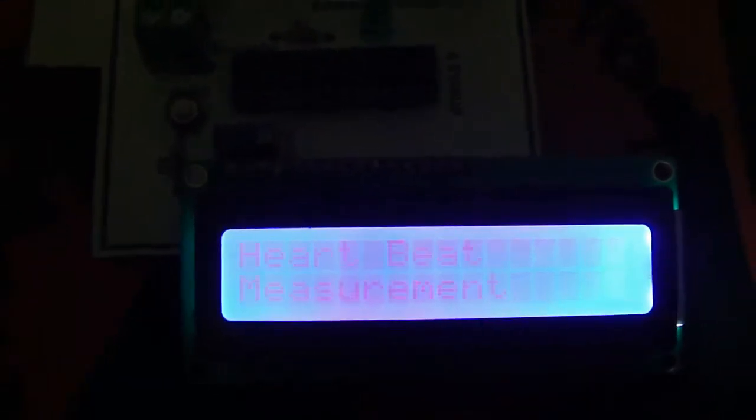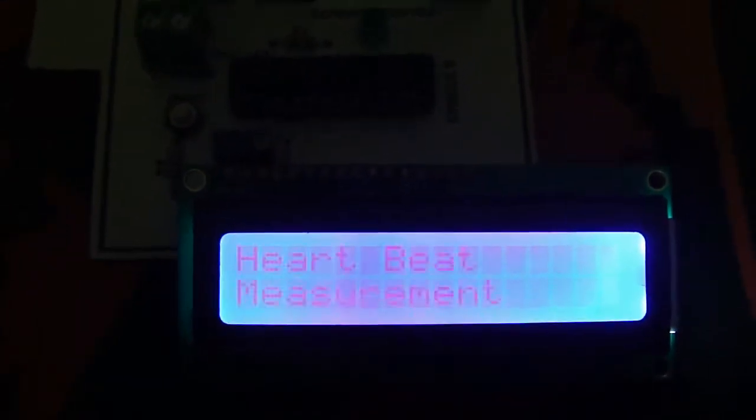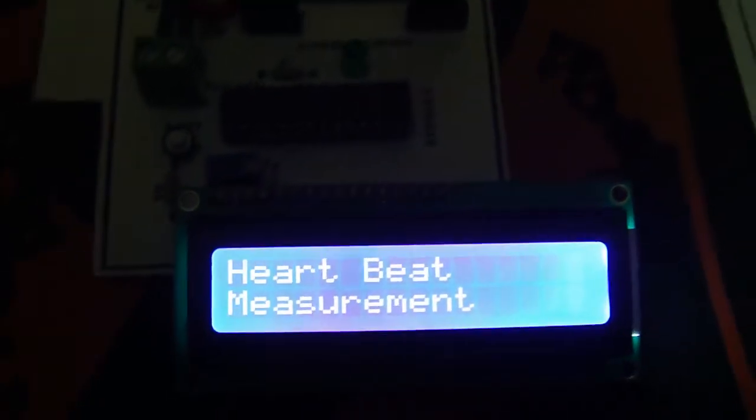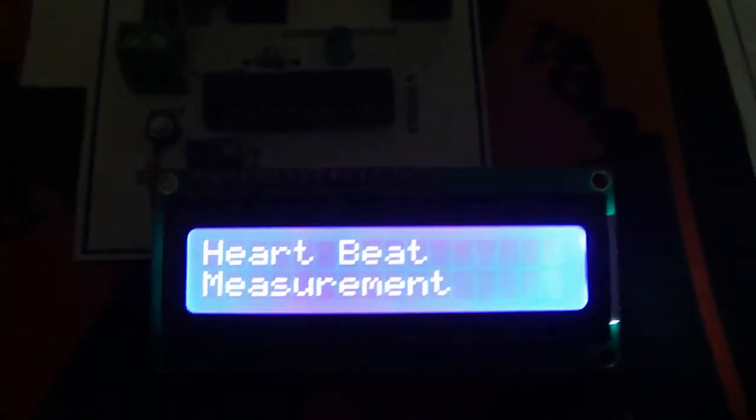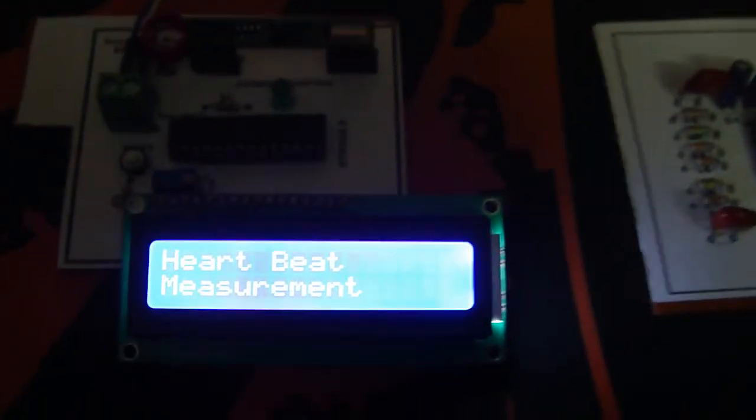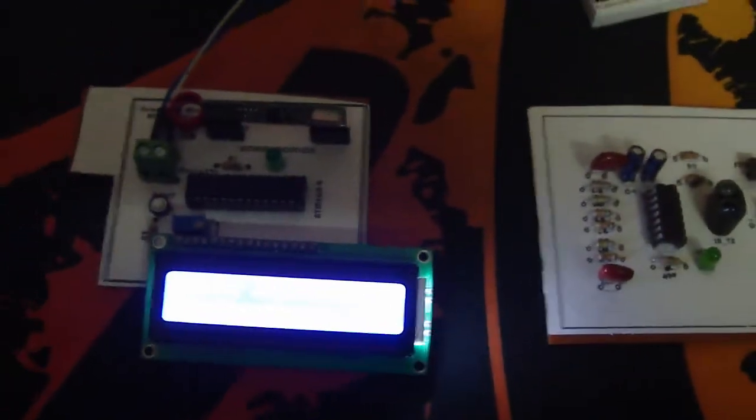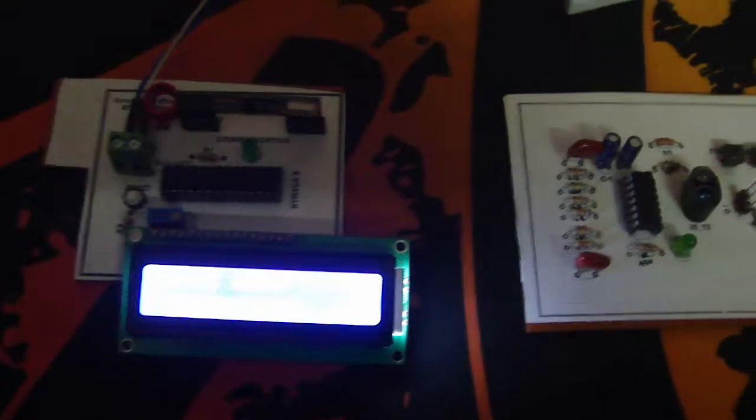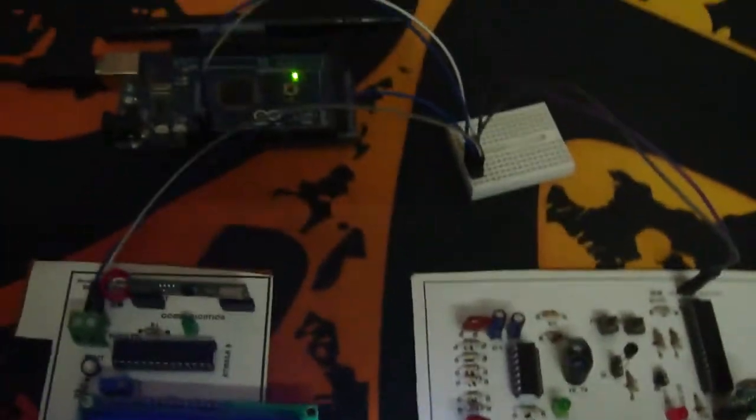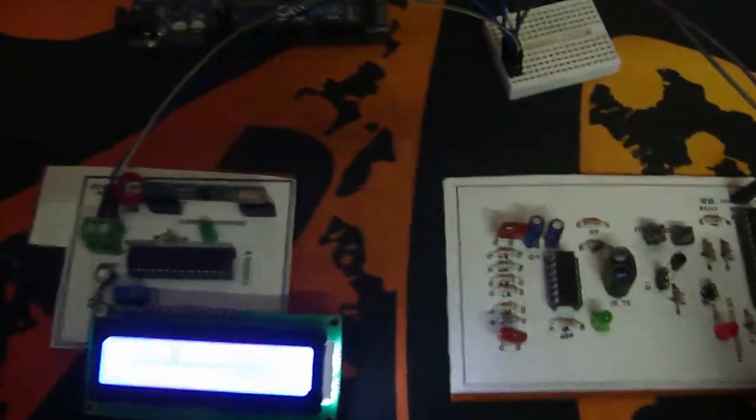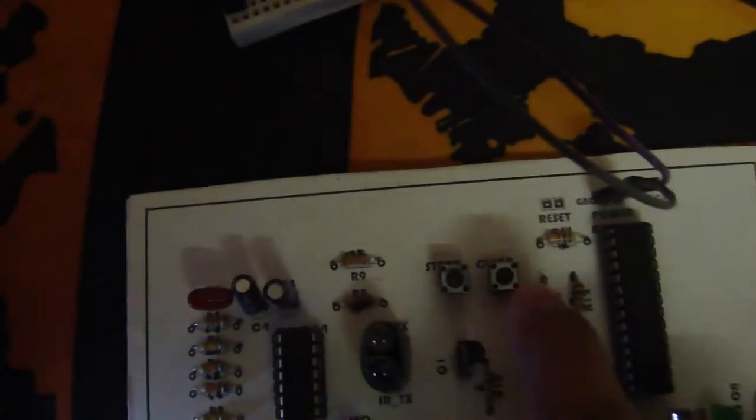You can see the initialization - it says 'Heartbeat Measurement System.' Both modules are now working. We need to place the finger on the IR transmitter and press the start button. You can see here the start button and clear button.